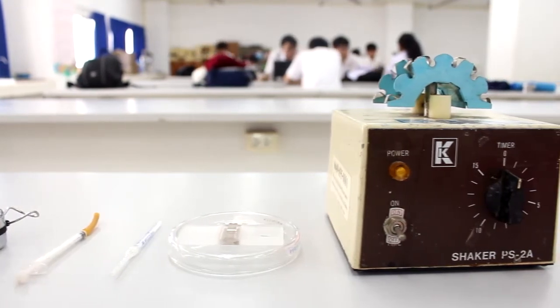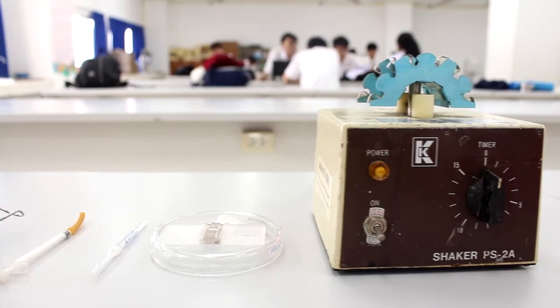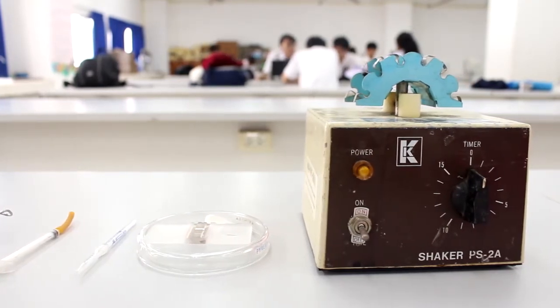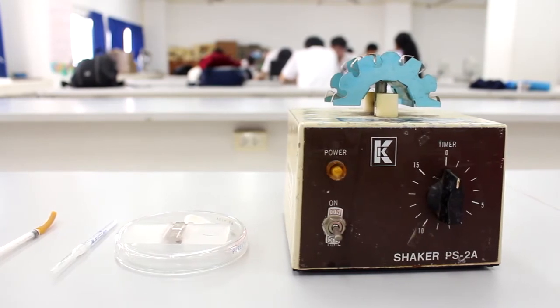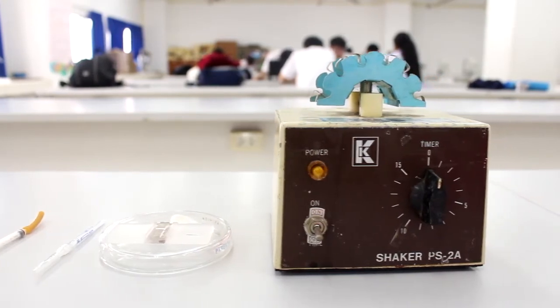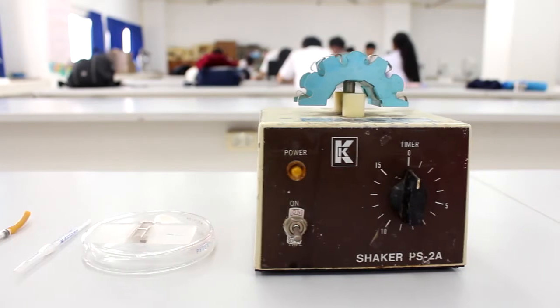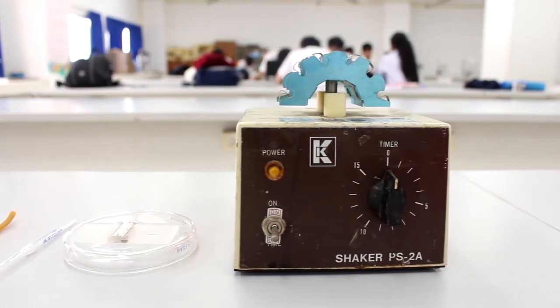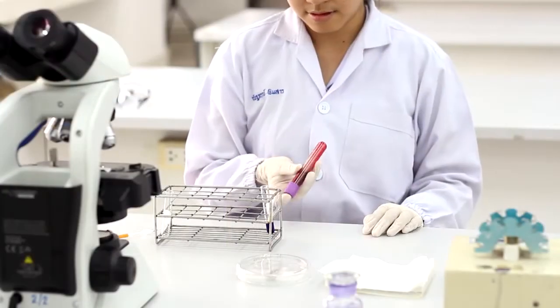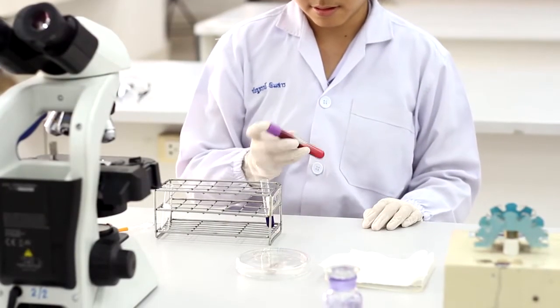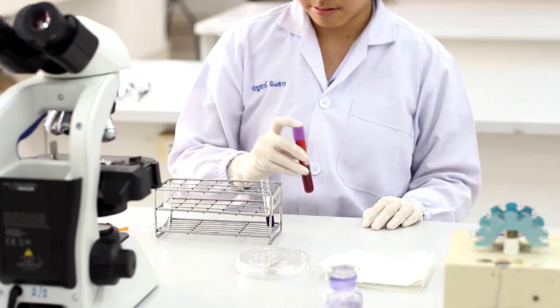The manual cell count uses a counting chamber with the most common one being the Levy chamber with improved Neubauer ruling. It is composed of two raised surfaces each with a 3 by 3 mm square counting area. Each area is made up of nine grids, composed of nine one by one mm squares.